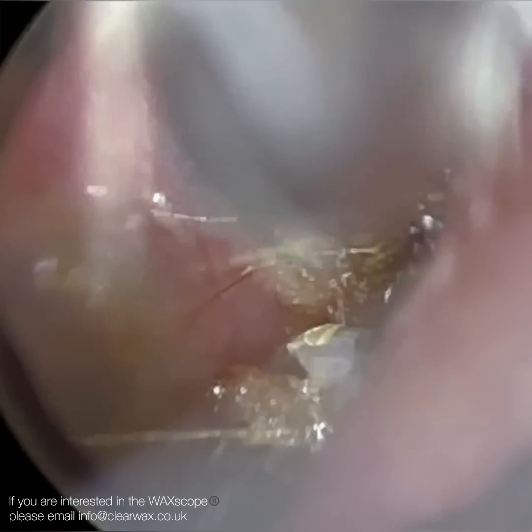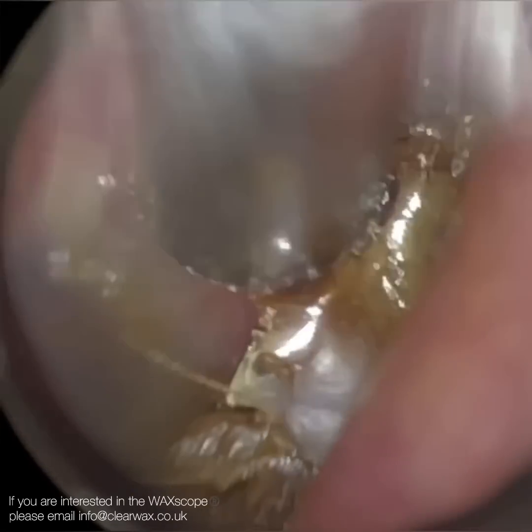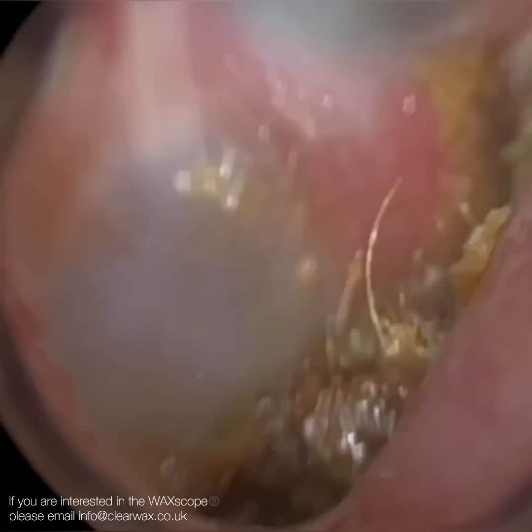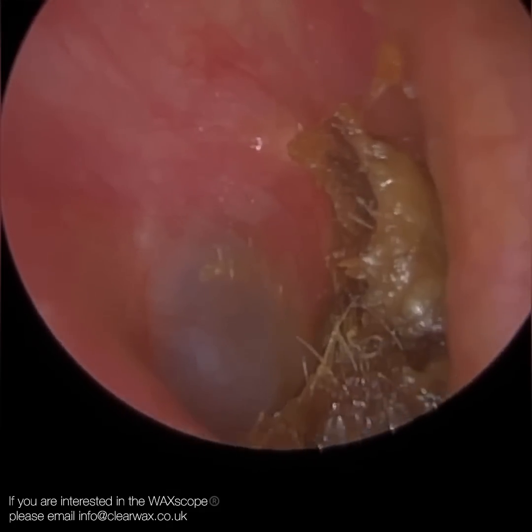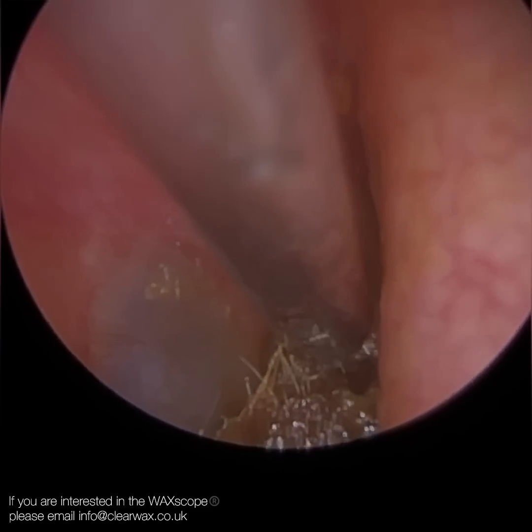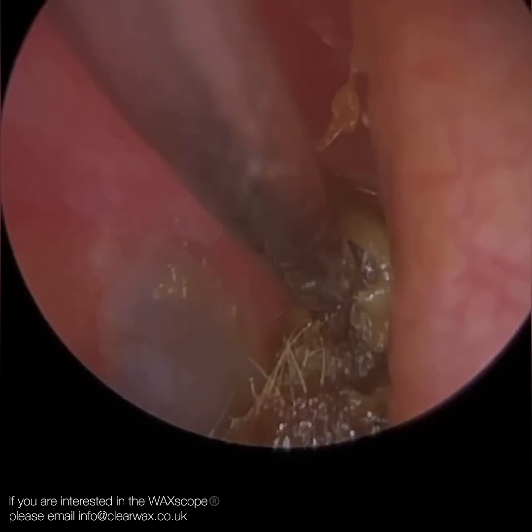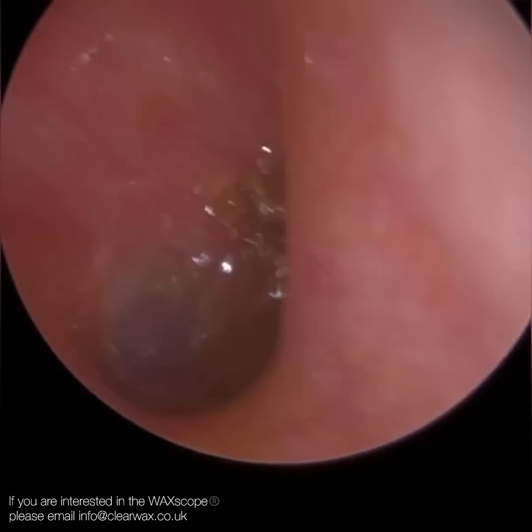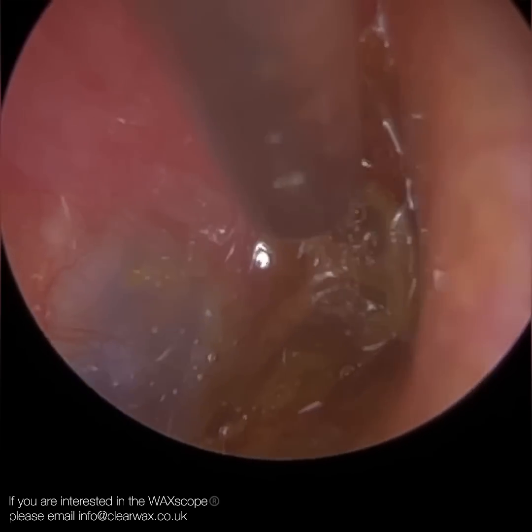I've zoomed in here — I need to be careful of that anterior canal wall to the right. That bone to the right is what the surgeon I watched chiseled away. They lifted the skin to expose the bone and used a combination of a diamond-ended drill bit and a bone curette to literally chisel the bone away, which straightened that portion of the ear canal. Here we are with the endoscope, the iClearScope, and you can see the beauty of it — a wide field of view.